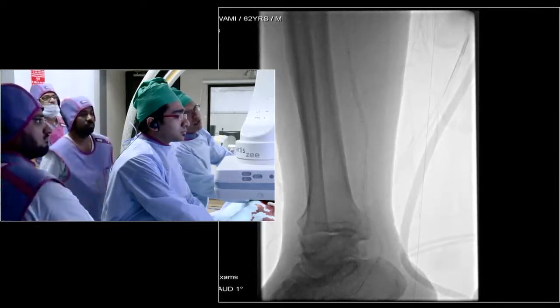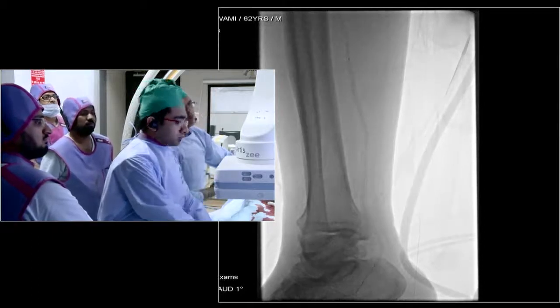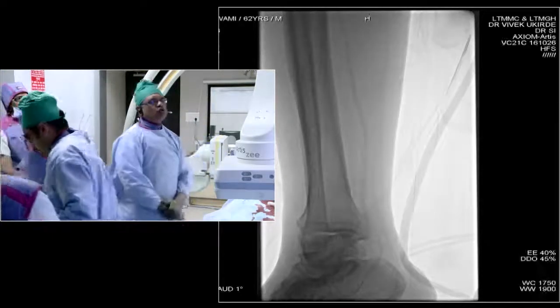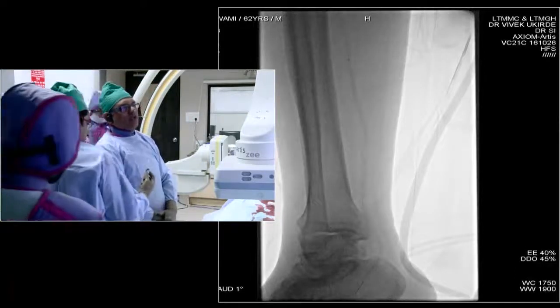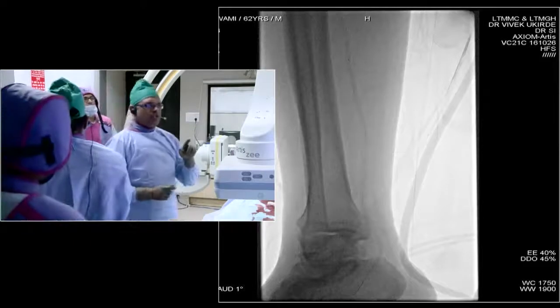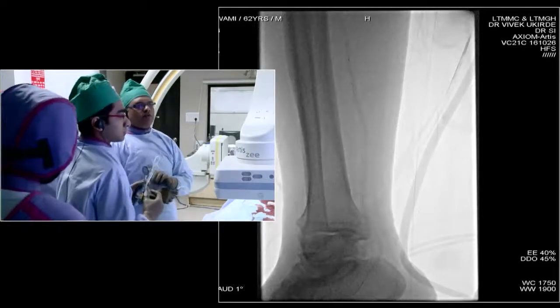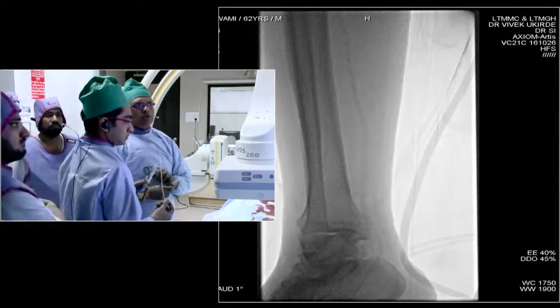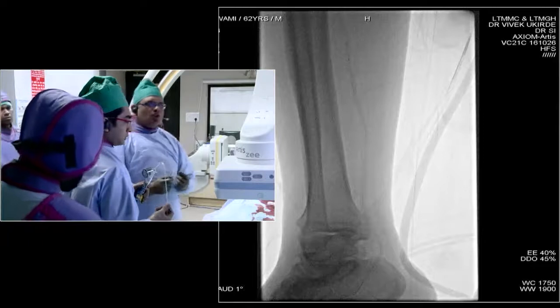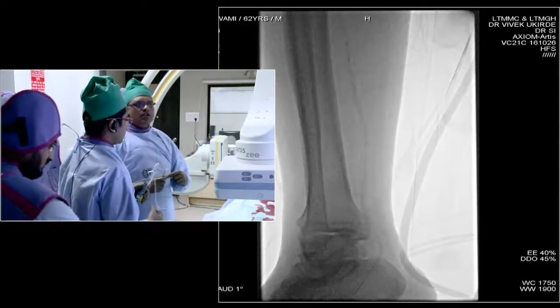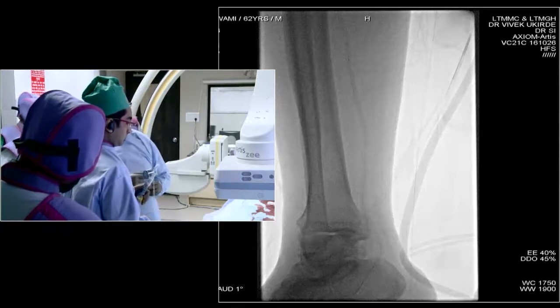What is the size of the balloon? This is 2 by 200. The plan is that I can treat the small segment also with the same balloon. The idea for selecting the longer balloon was that I did not want plaque disruption — it is a small size vessel with calcification, so if in one go I can angioplasty the longer segment, that will be better rather than repeating multiple plasties.